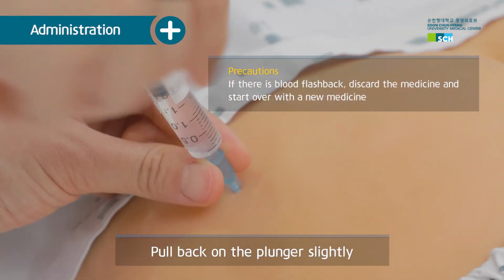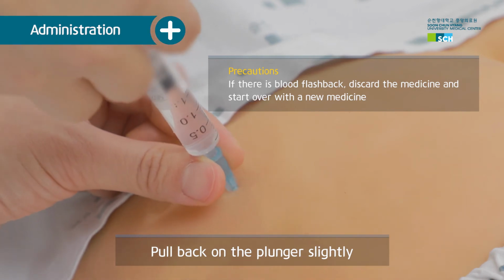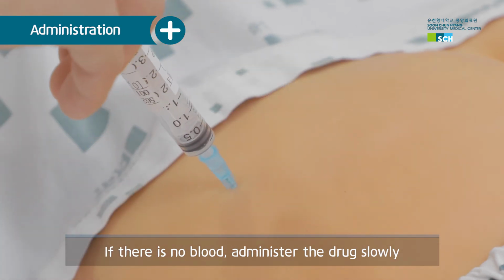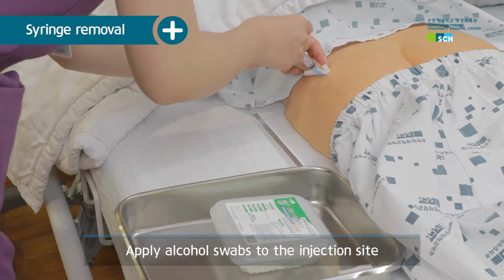Use the index finger and thumb of the hand that stretch the skin and hold the lower part of the syringe to stabilize it. Use the other hand to pull back on the plunger slightly to look for blood. If there is no blood, administer the drug slowly. If there is blood, discard the medicine and start over with a new medicine.